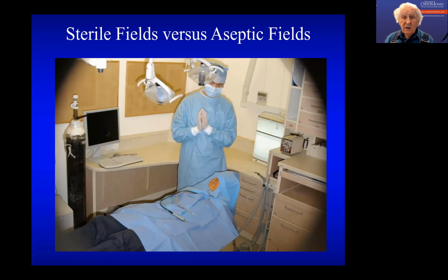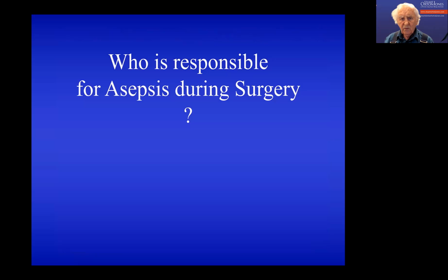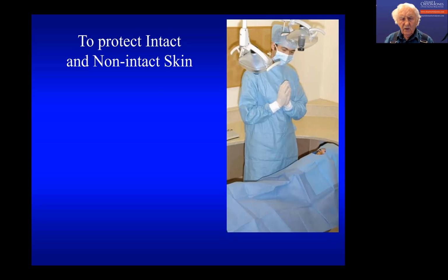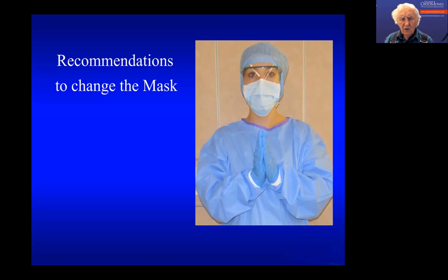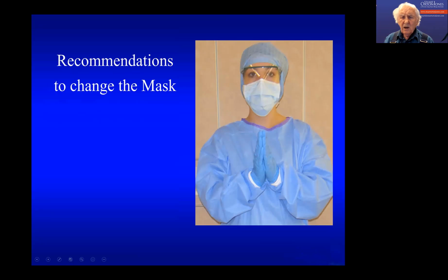Here the surgical assistant has draped the patient. They've prepped the patient with betadine, and then put the drape over the patient. Now, here's the assistant ready for us to do surgery.